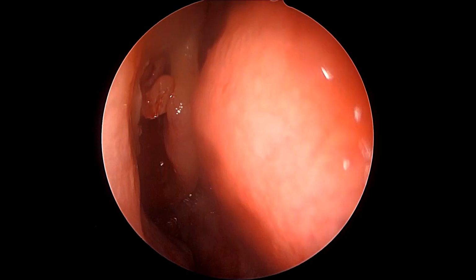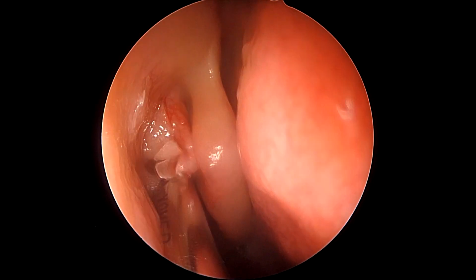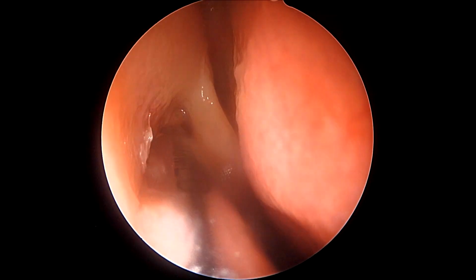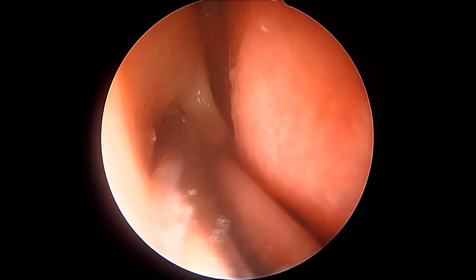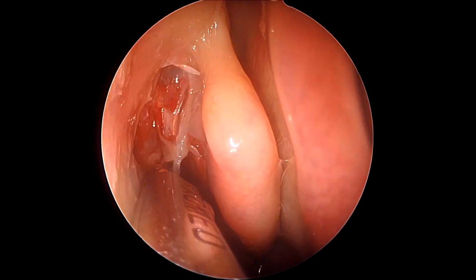Now, once we have fractured all these contents, we can simply use a 0 degree or a 40 degree microdebrider blade to remove all this redundant thin septations of bone and the excess mucosa to give us a clear view of the anatomy.